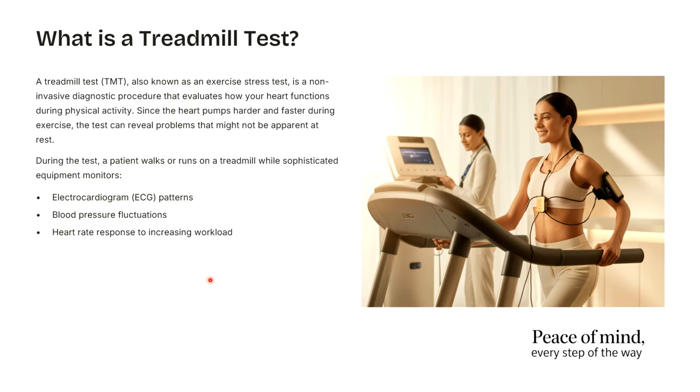But when that particular person is forced to run on a treadmill, then he or she might not cope with the stress of the exercise, and then the doctors or the cardiologist can identify the hidden problem of his or her cardiovascular system.